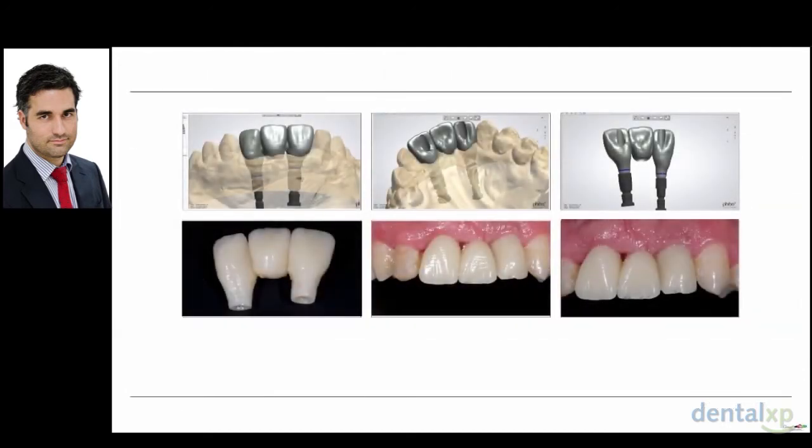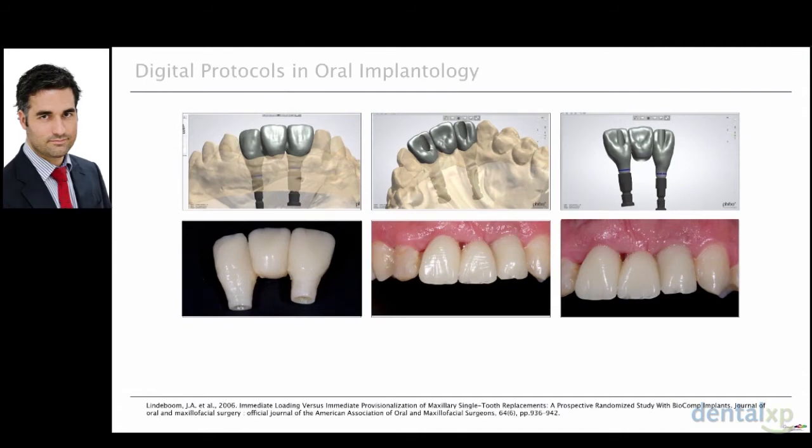So here we have the design of your provisional prosthesis, and it was manufactured in PMMA. I use PMMA because it is a material that, when manufactured under industrial conditions, doesn't release monomers. This is important because monomers can cause some irritation and some recession in the soft tissue. That's why I always use PMMA when I'm going to do a provisional restoration.